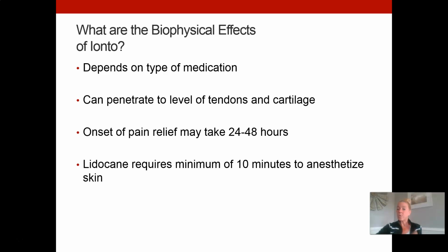So when we were doing e-stim before, especially for pain control and things like that, the person almost had an instantaneous relief of pain. That might not always happen with Ionto. Some people do. Some people walk out of the clinic and they feel a little bit better. Some people, it really does take a day or two before they start to feel the results. So just to let your patients know that, again, this might not be right away. It might take a little bit of time before they start to feel better.